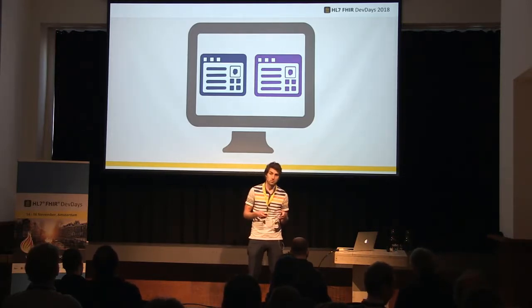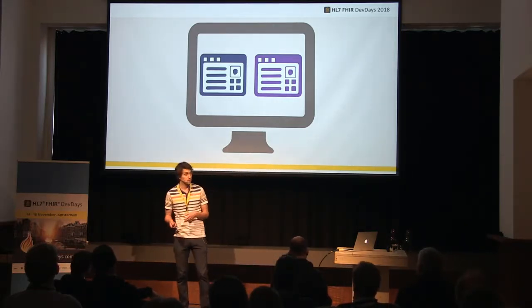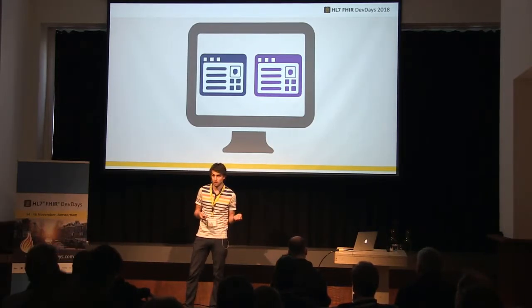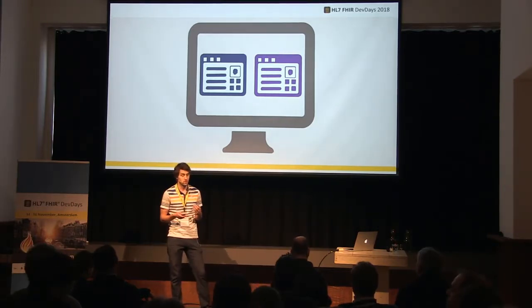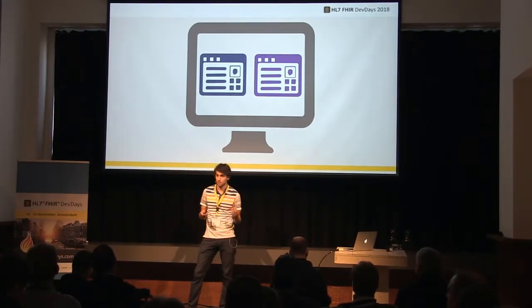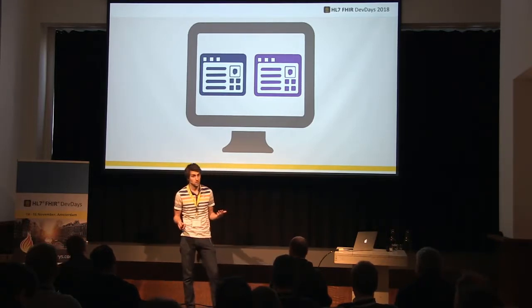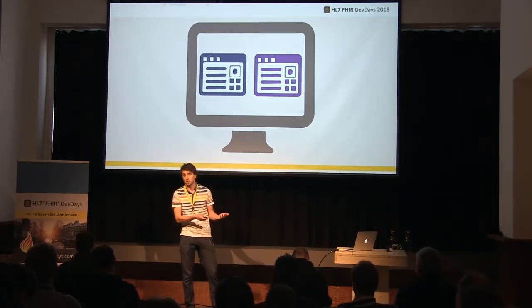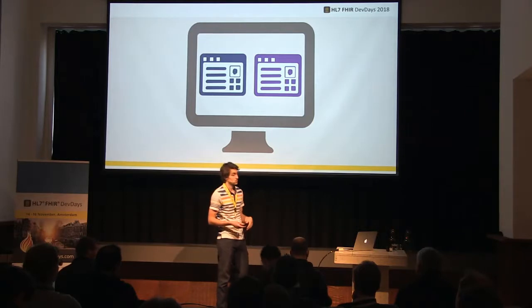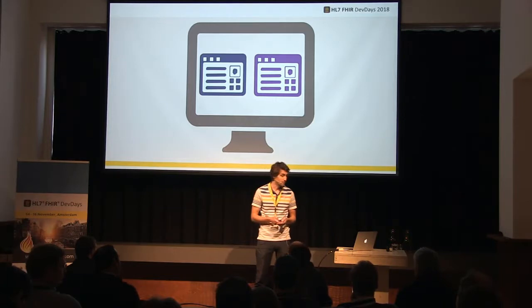So today this is solved by multiple implementations depending on which vendor and which site. Many of the EHRs have their own proprietary ways of doing desktop synchronization. Many PACS vendors, like where I work, have our own proprietary way of doing this. So which one do you choose? Well, you need to choose one, and the other vendors need to implement that proprietary way of doing it for every new vendor, and possibly even worse, for every site. So it's kind of a mess today, but that's what we have.